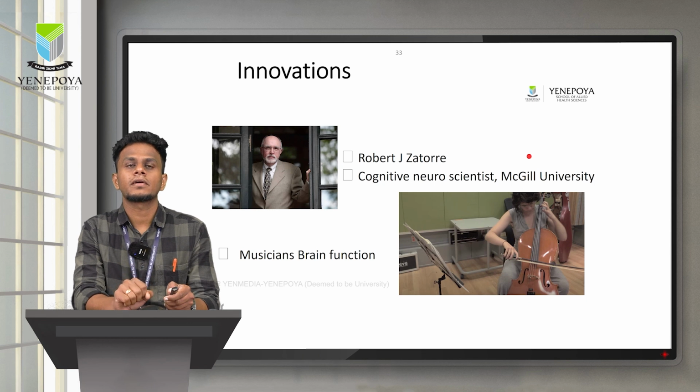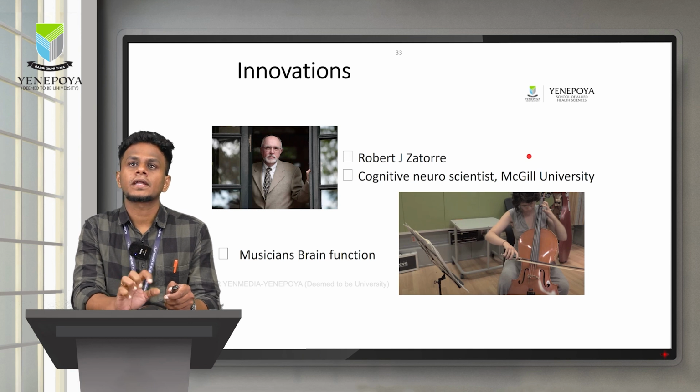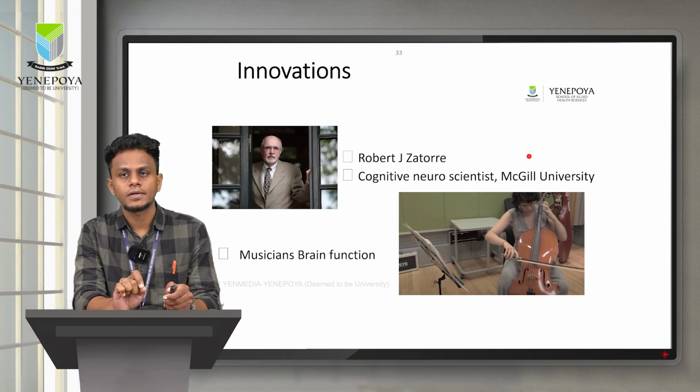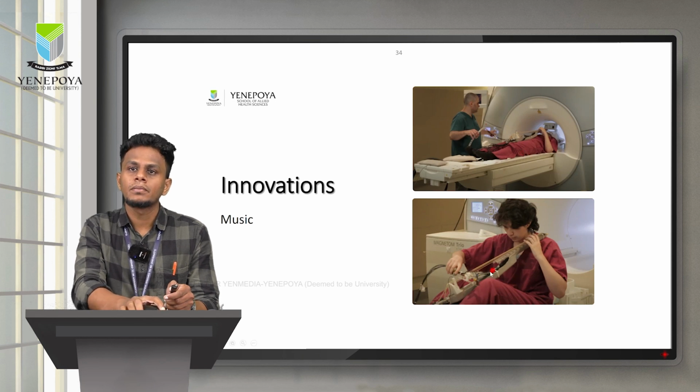There is one interesting innovation by Dr. Robert J. Zatorre, a neuroscientist at McGill University. He studied musicians' brain function. Normally musicians perform using cellos and such in concerts, but he made a separate piece of equipment compatible with MRI, using fiber optic cables. He made the patient lie inside an MRI, and she performed as if she was playing the cello inside the MRI.